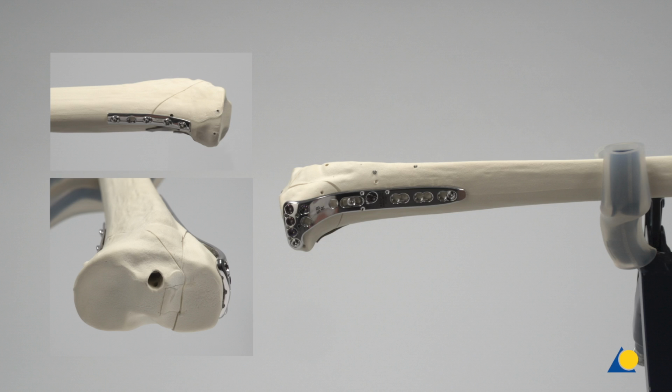Locking screws can be used to limit toggling in the cancellous bone of the medial condyle without having to protrude through the medial condylar surface, thus irritating the medial collateral ligament. In this demonstration, a bicondylar fracture was shown and locking screws were inserted to improve the stabilization of the medial condyle. In the situation of a unicondylar lateral fracture with good bone quality, only non-locking screws would be inserted.